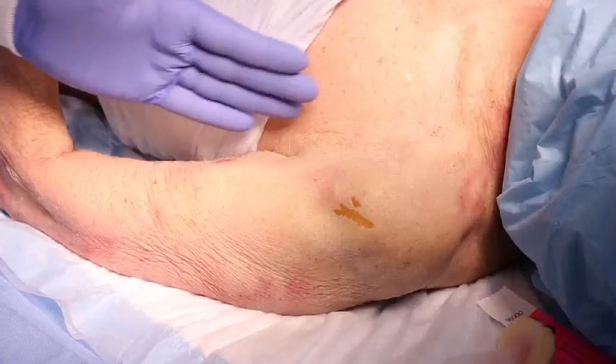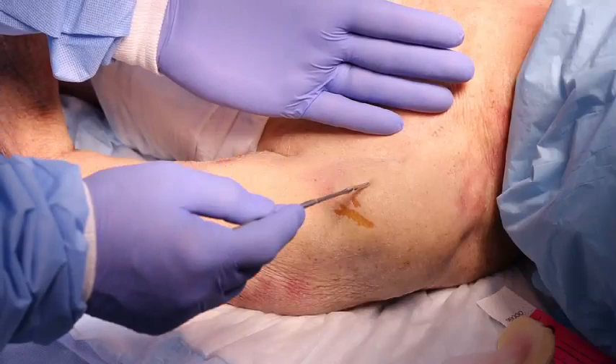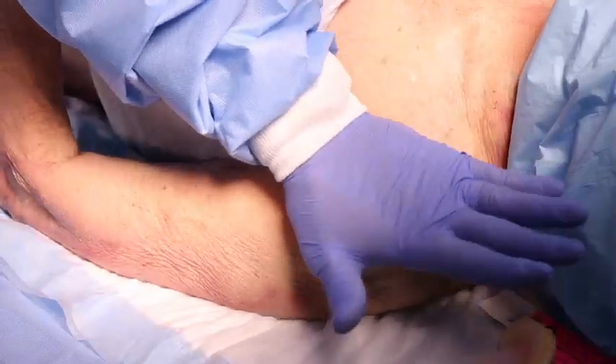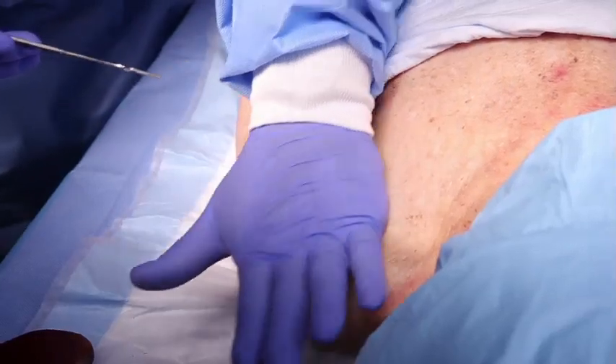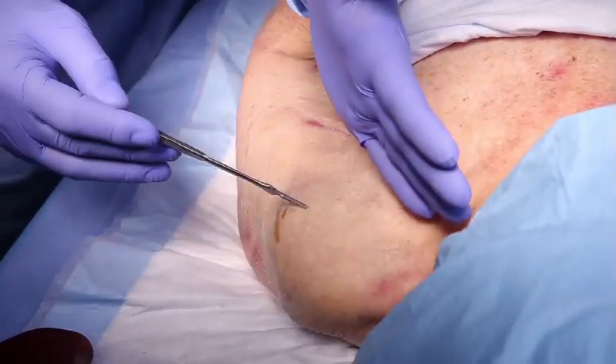Place your palm on the patient's shoulder anteriorly. The area that feels like a ball under your palm is the general target area. You should be able to feel this ball even on obese patients by pushing deeply.